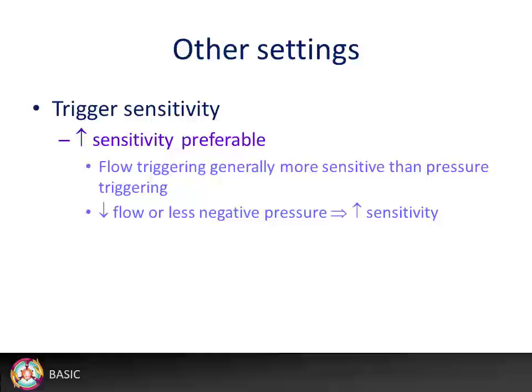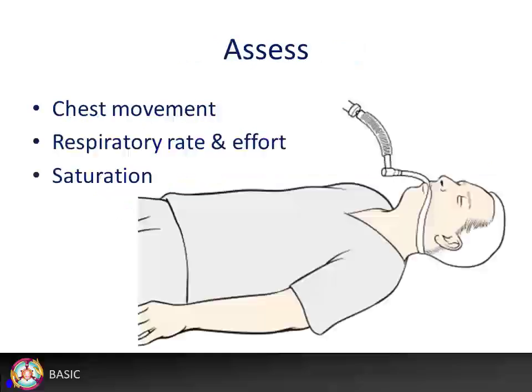Triggering may be flow-triggered or pressure-triggered. Flow-triggering is generally more sensitive. The smaller the flow or the smaller the negative pressure, the more sensitive the trigger.